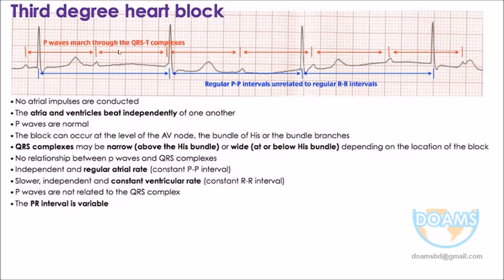RR and the PP. So in the real sense, in the ECG, discovering the relationship may sometimes be difficult. It may show you that it may be Mobitz type 1, Wenckebach, with progressively increasing PR interval and some drop beat. But Wenckebach will not have a heart rate as low as complete heart block. So here heart rate can help us. What will be the common heart rate in complete heart block? Around 40. Remember it. Then it will guide you whether it could be the Wenckebach phenomenon or complete heart block.